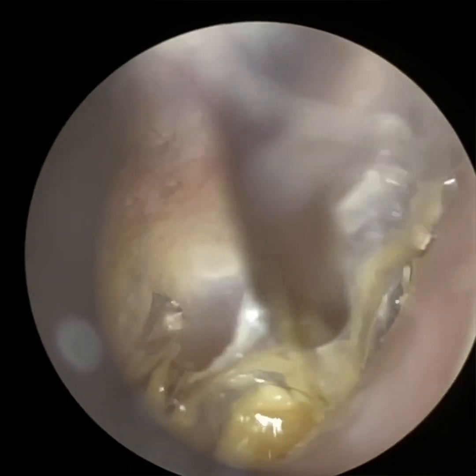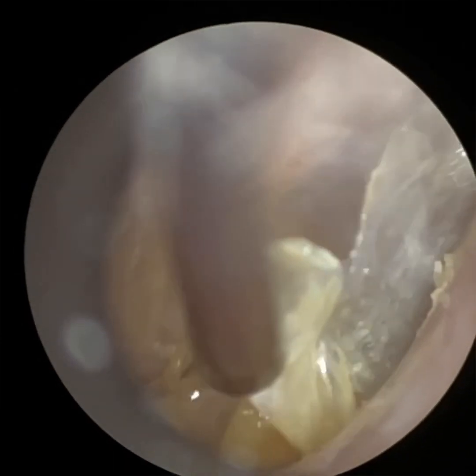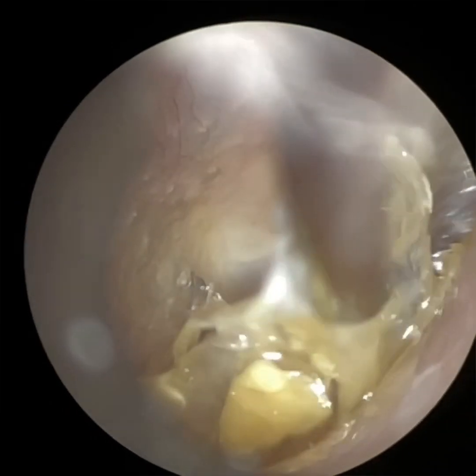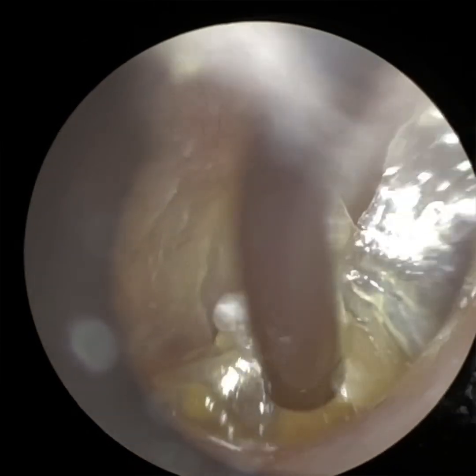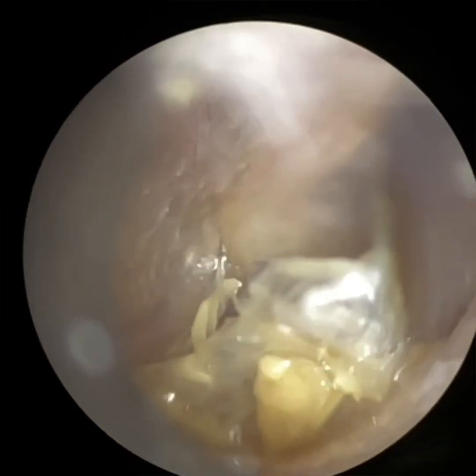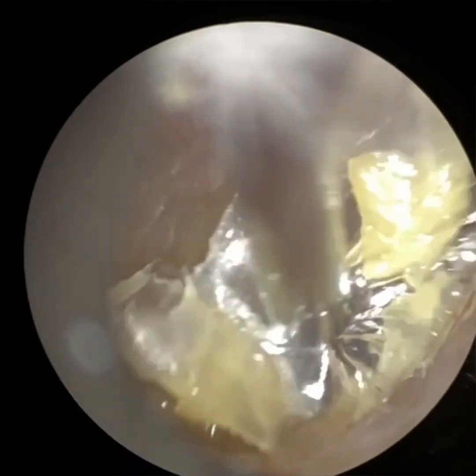There are some decent ones out there, but I've used them before, and it's my personal opinion, I would really struggle to perform a procedure like this using head microscopes. And they're very difficult to retain focus. The slightest head movement from the patient or even yourself, you lose focus, and you don't get the magnification like you are getting here. So that's the reason for the WAXscope.